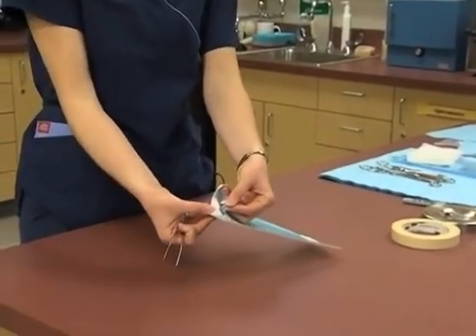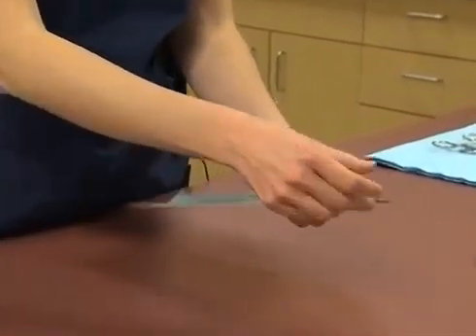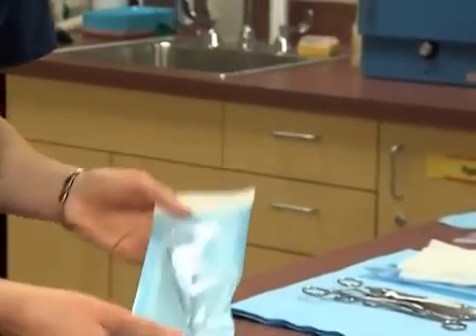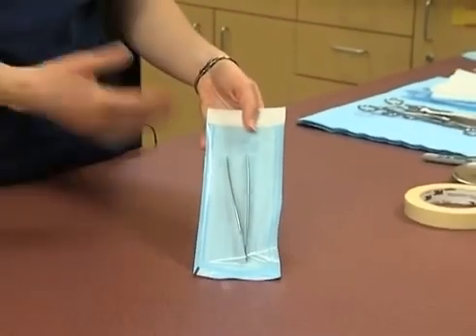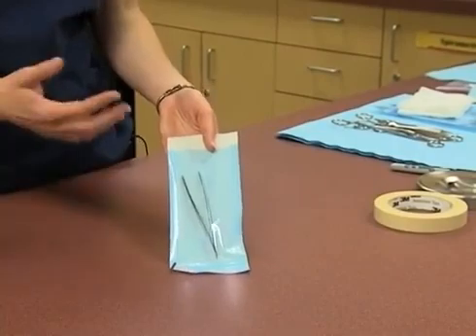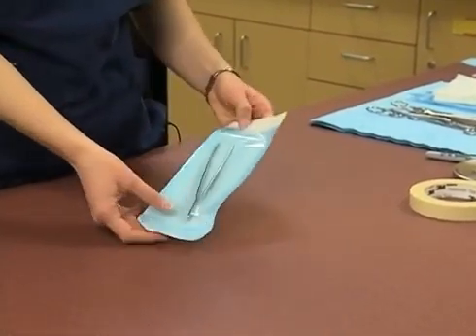When we're putting in instruments, one of the key things is that when we actually open them, they're opened in this direction. So when we place an instrument inside, we want to put it handle down first. This instrument stays open by itself, so we don't need to worry about having any cotton in there. If we were placing an instrument in here with hinges, we would place cotton within the hinges.